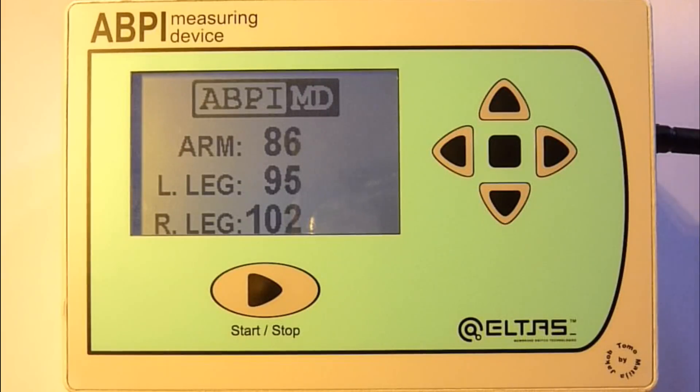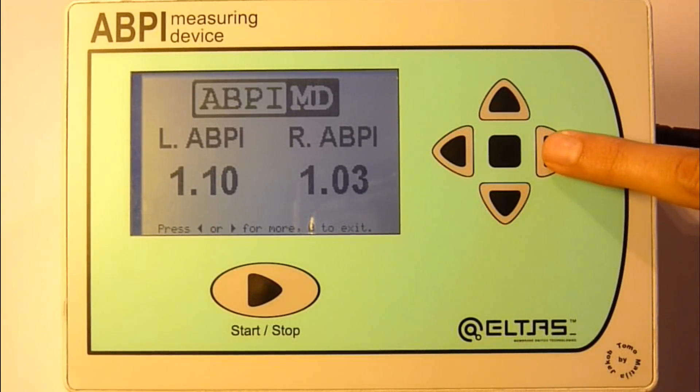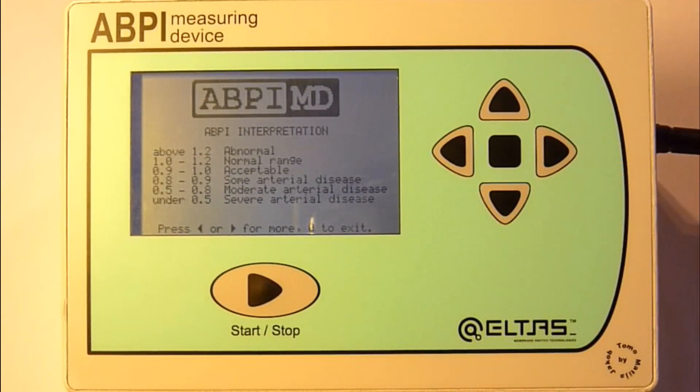When the measurement is finished, the device shows the left and right ABPI on the screen. Navigation buttons allow for movement between menus and therefore insight into the systolic pressure in each extremity and the explanation of the result.